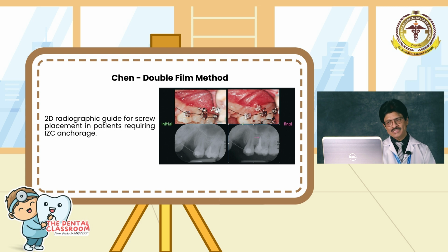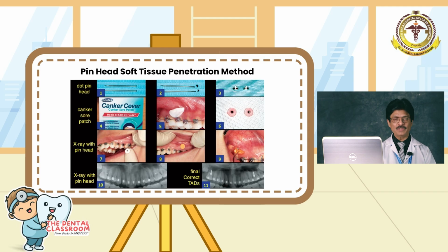Well, for the novice, you can use a double film method, which is a 2D radiographic guide for screw placement in patients requiring IZC anchorage. You can also use a pin head soft tissue penetration method. Means to say, if you have these dot pin heads, you just cut the head of the pin and take a canker sore patch, place the base of it onto the canker sore patch. For example, wherever you want to place.